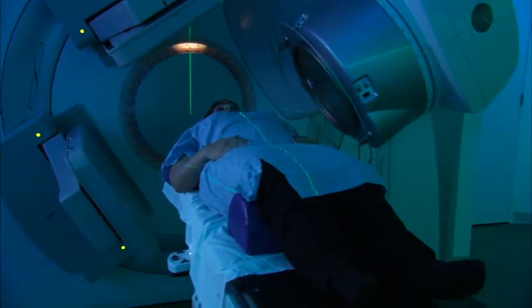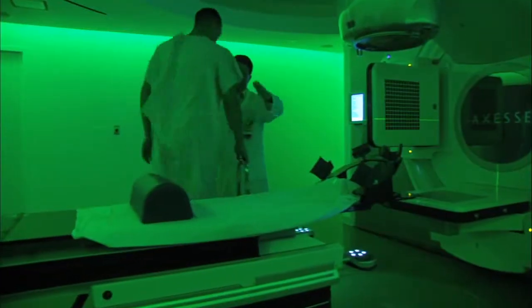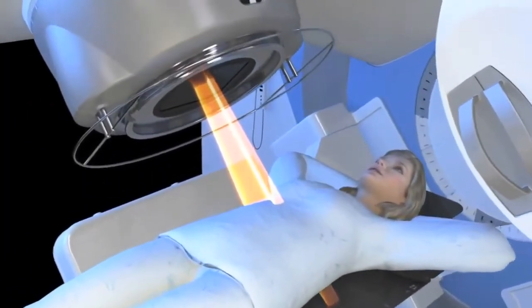We actually take images both before and during treatment to ensure that the position of the patient is right on, as well as we can see the tumor and how it's changing from one fraction of treatment to the next. With multiple built-in equipment and software safeguards, radiation therapy is used to treat hundreds of thousands of patients safely each year.